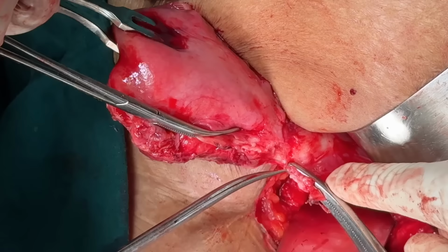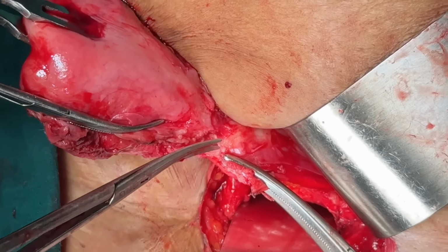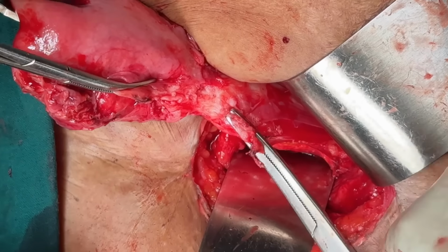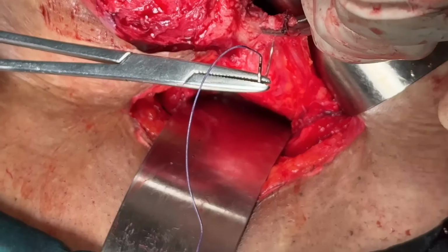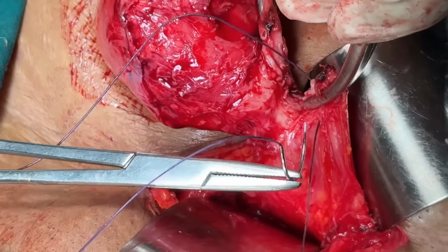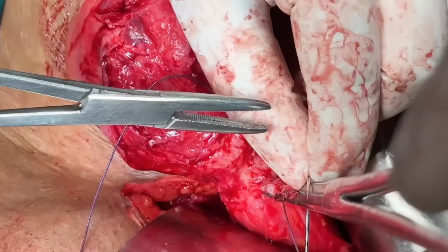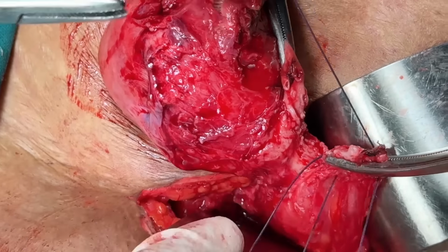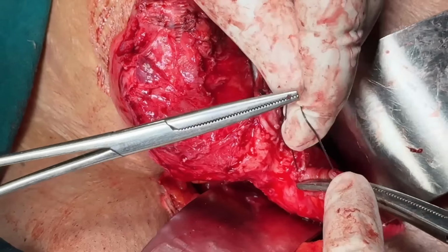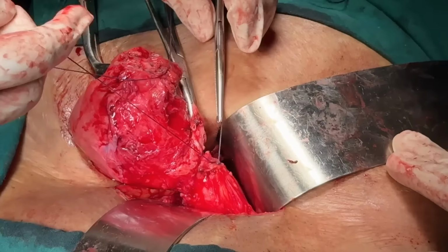Put a nice L-shaped incision before transfixation to have a nice pedicle. Then transfix. Throughout the hysterectomy, the suture material we are using is Vicryl number 1. The loop should always come behind the back of the clamp, and the knot should also be tied behind the back of the clamp. I will tell you how to put the knot once.